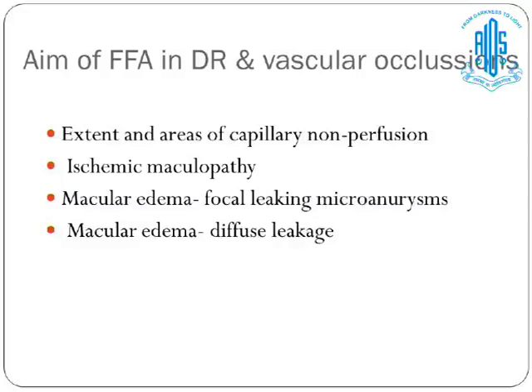Now, the aim of FFA in diabetic retinopathy and various vascular occlusions is to detect the extent and areas of capillary non-perfusion, ischemic maculopathy, and to diagnose whether the macular edema is focal or diffuse, because the treatment differs in both.